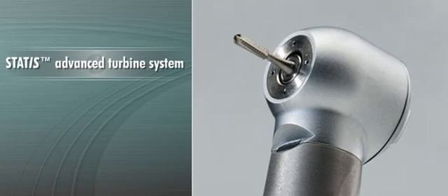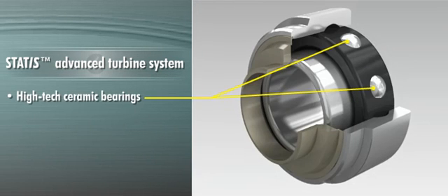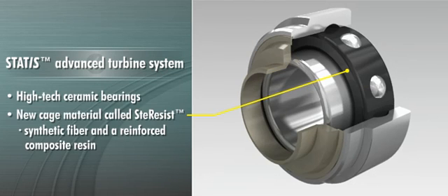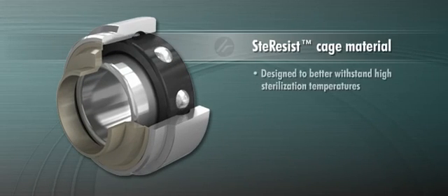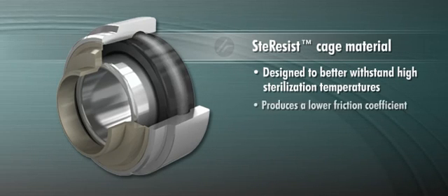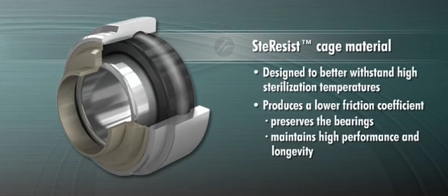One of the most important features of STATIS high-speed handpieces is the advanced turbine system. STATIS high-speeds come with high-tech ceramic bearings and a new cage material called STERESIST, made of synthetic fiber and a reinforced composite resin. STERESIST is designed to better withstand high sterilization temperatures and produce a lower friction coefficient — key factors in preserving the bearings and maintaining high performance and longevity of the handpiece.